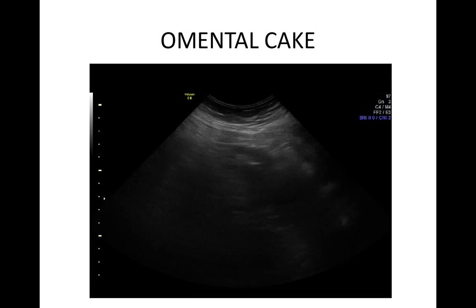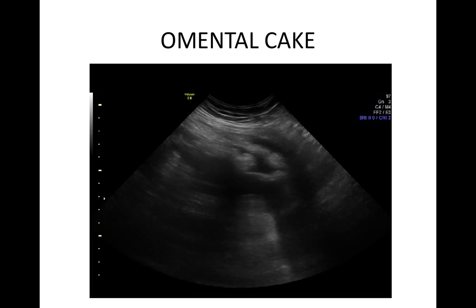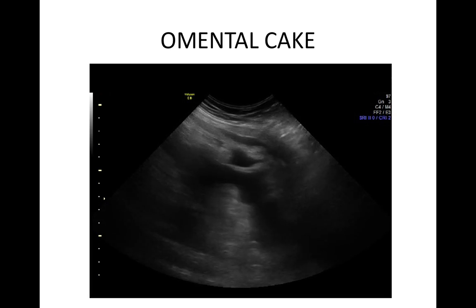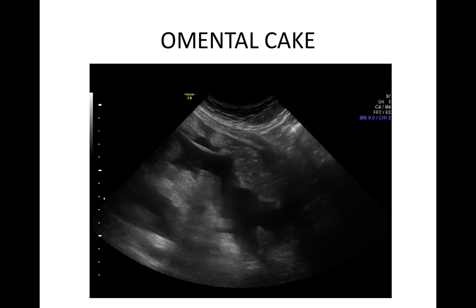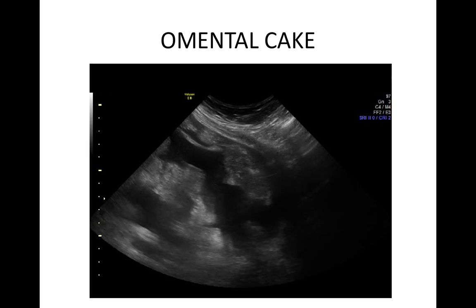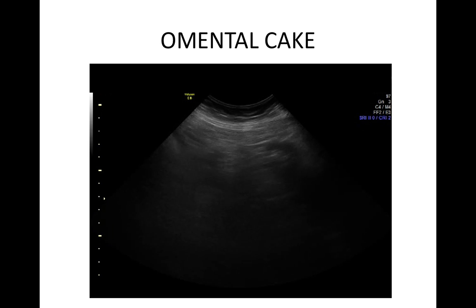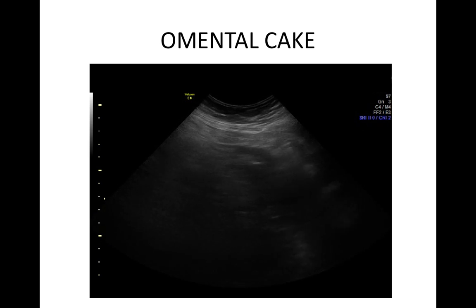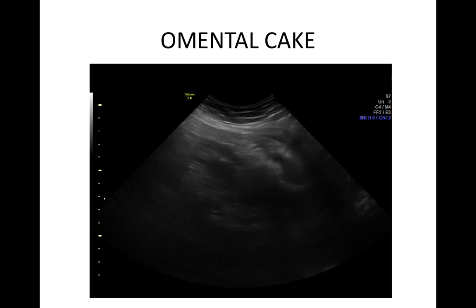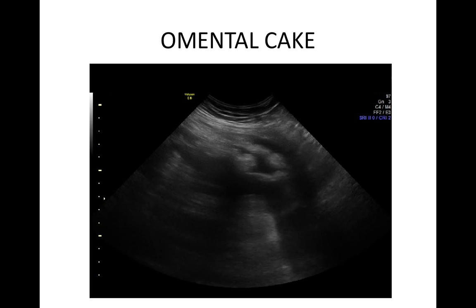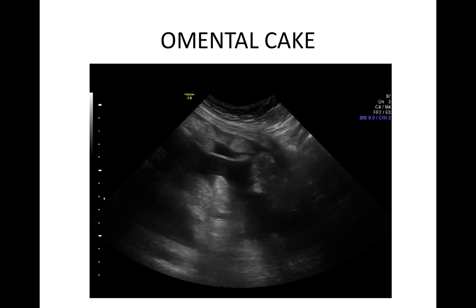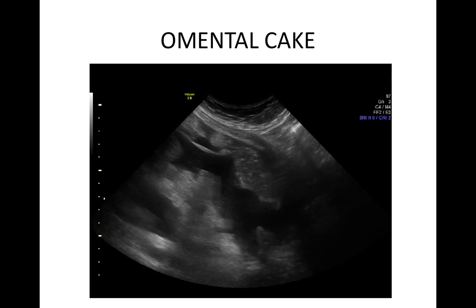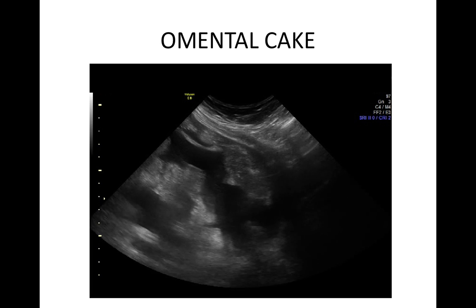You can see whether the tumour has metastasised to the omentum by scanning in the epigastrium in the longitudinal plane. The omentum is normally difficult to see, but when there are metastases the resulting omental cake can be quite obvious, floating in ascites.